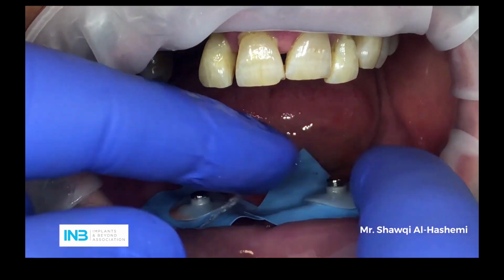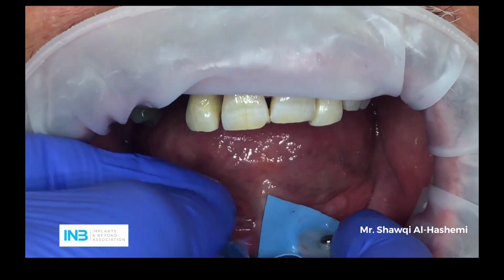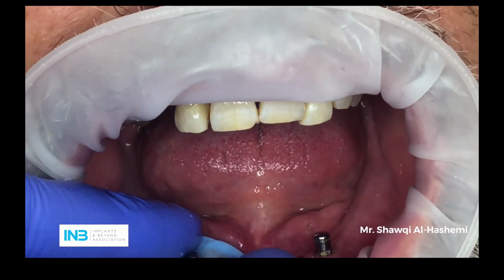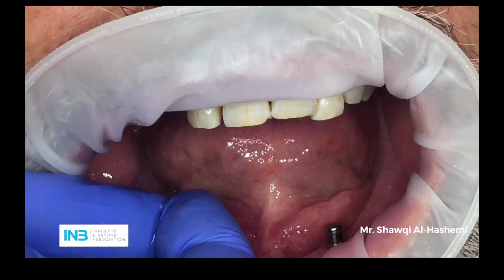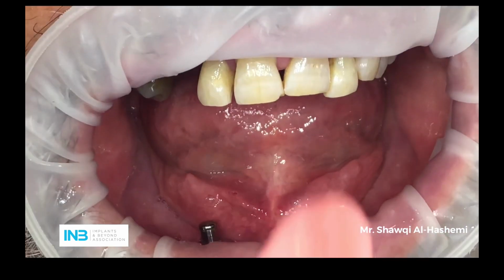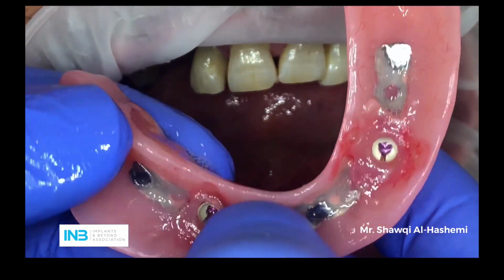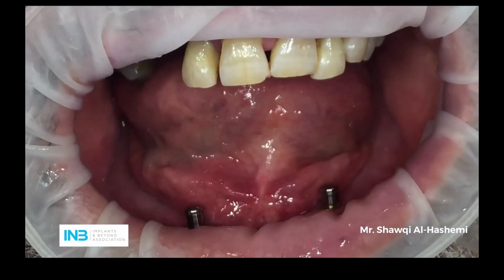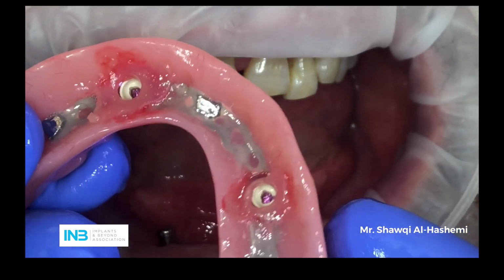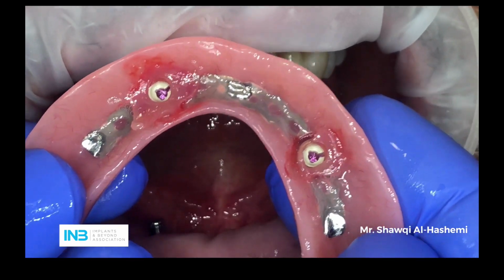We can easily remove these if we are not happy with the retention, but the retention is superb here. So we're just going to remove the rubber dam. Then we are going to polish this bit, remove any excess acrylic, make sure it's not rough, and then click it back again and see if necessary whether we change the actual housing. It depends on the retention that you want.